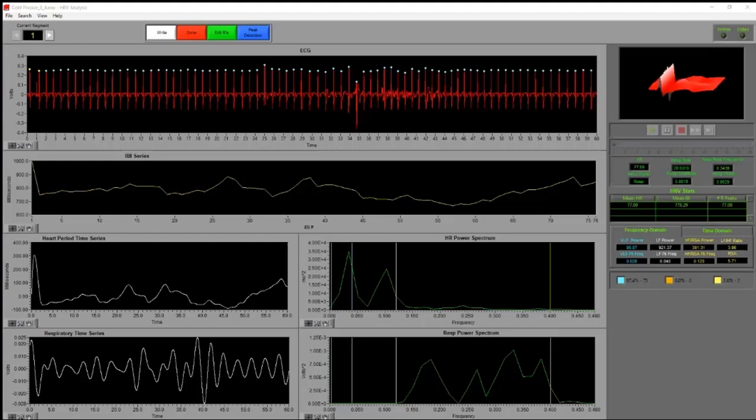And sorry, the last part of that question, as far as the variance and how we would interpret RMSSD. Certainly everything's to a point, and if the data looks clean, a higher RSA or higher RMSSD would be interpreted as more parasympathetic control. So an increase in RSA, an increase in RMSSD, means an increase in vagal mediation.